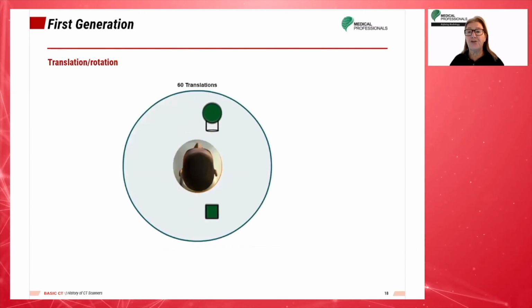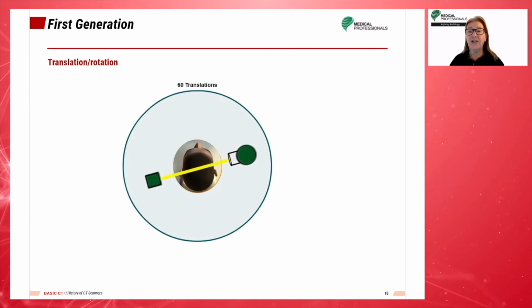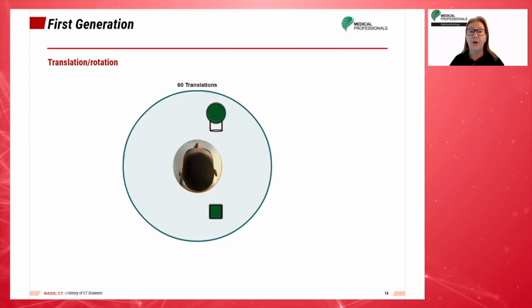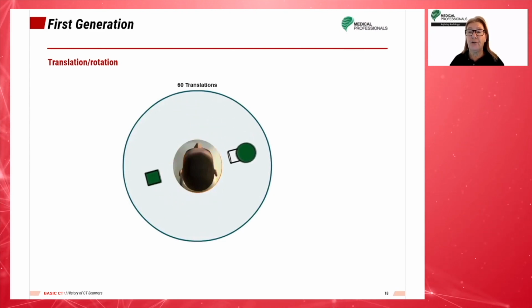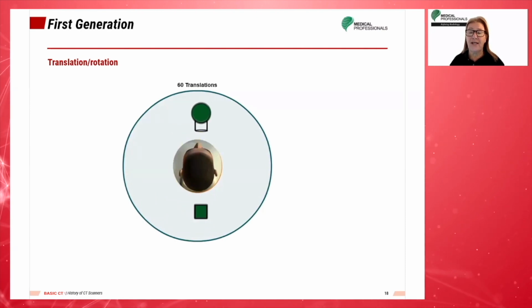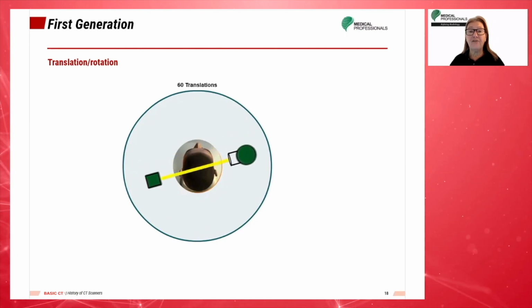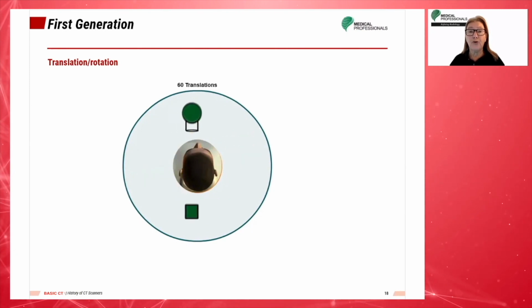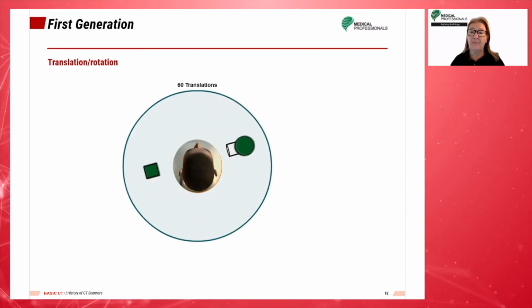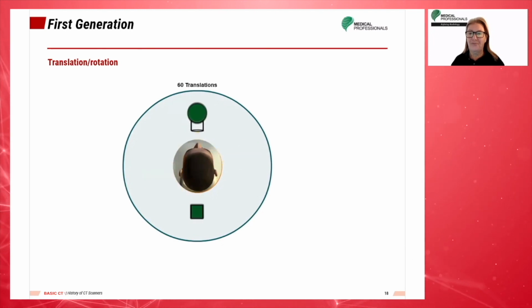The first generation was a head unit only. It used a linear scan motion at each degree from 0 to 180 degrees, with rotation paired with a single detector. It took about 4.5 to 5 minutes scan time per slice, using a single ray pencil beam. Things advanced quickly from here.